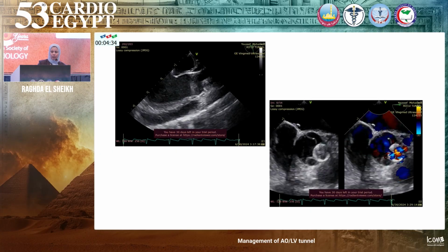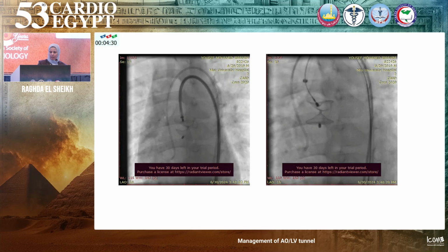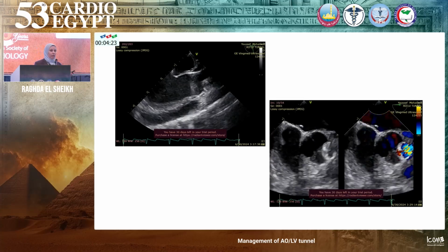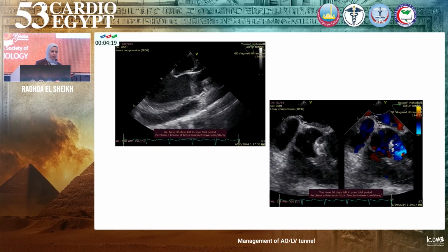And actually, after putting it, I have certain important measurements. First, the aortic valve. I must stay away from the aortic valve. Here, the cusp is moving well. I have no aortic incompetence, and this is one of the major aims after putting the device.